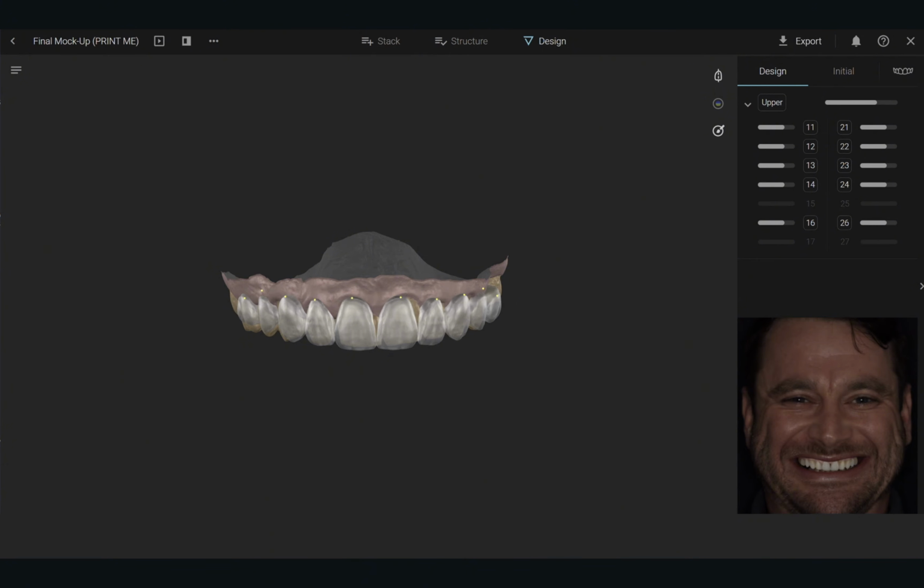It's really effective. Traditionally, once upon a time, when I would look at 2D and I was translating to 3D, it was a bit of an art form. Like there wasn't an exact science, because with 2D photos, yes, you are always going to have warping, but that's why we were benefited by the fact that we have a lovely, large and long photo studio. So we're able to have a bit more space rather than having that fisheye effect. But Exocad could compensate for that to some extent, not entirely though. And so I'm always pleasantly surprised how it will spit out this initial recommendation.